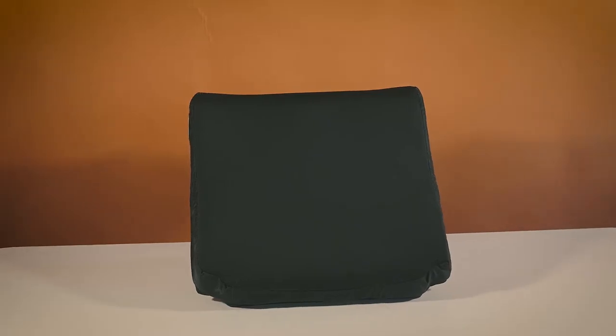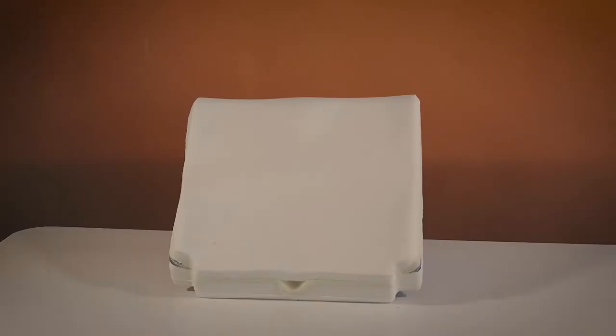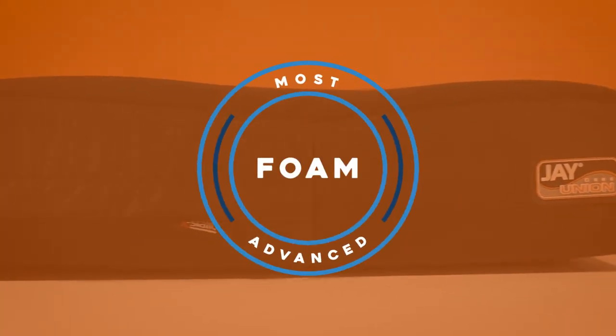Even the J Union's cover has two layers, with the inner layer designed to be totally waterproof and the outer layer designed to be comfortable, breathable, and even antibacterial. At just over $300, the J Union Wheelchair Cushion earned our pick for the most advanced wheelchair cushion in the foam category.